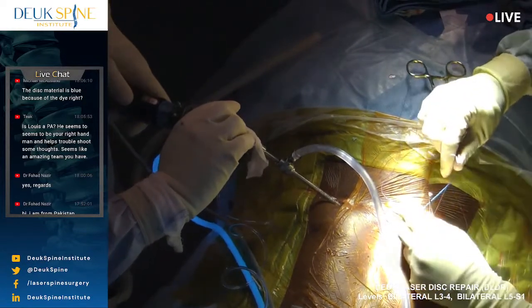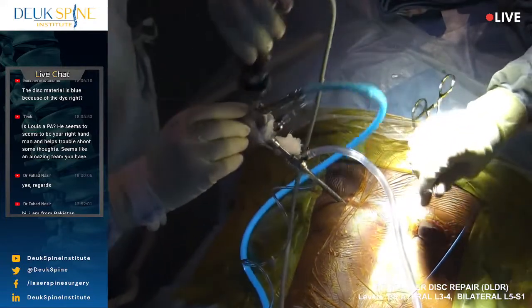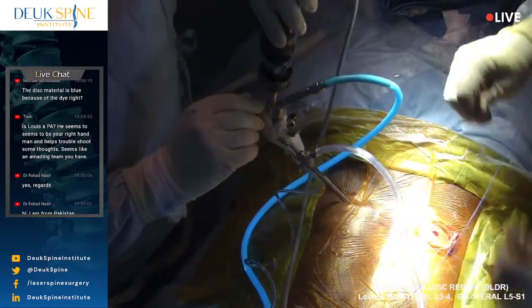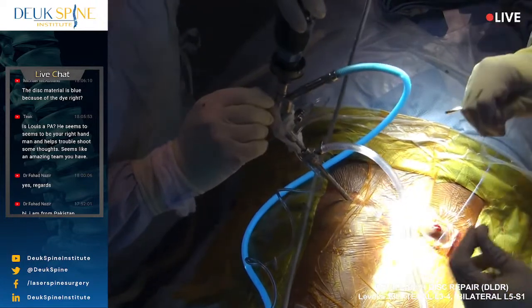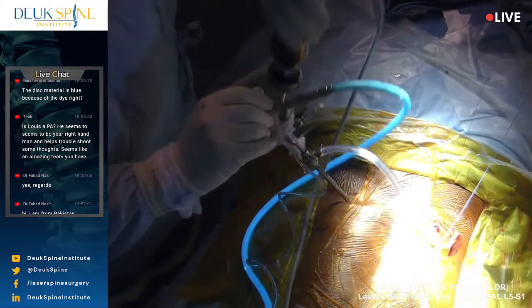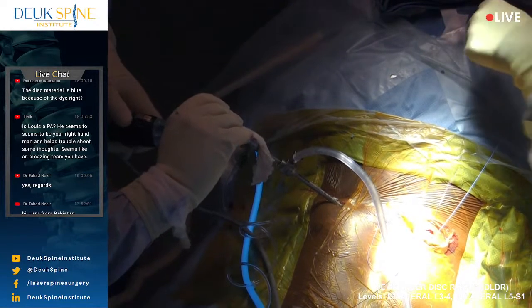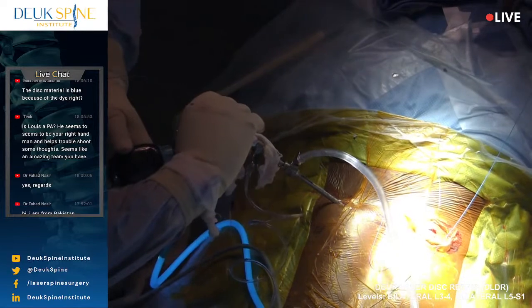Again, this is that disc that's really scarred up. So, not like the last one that was a complete soft blowout, like a jelly blowout. This thing is scarred up from years. This is the 9-year-old injury disc. The other one is something far more recent. It's not uncommon for patients to have disc injuries at different times that are different ages.